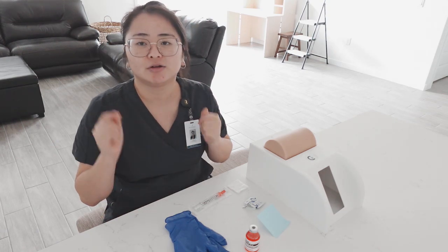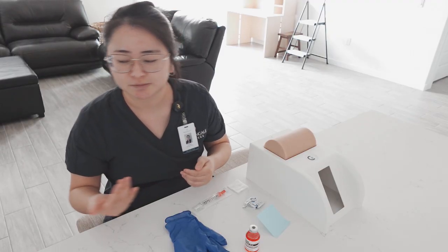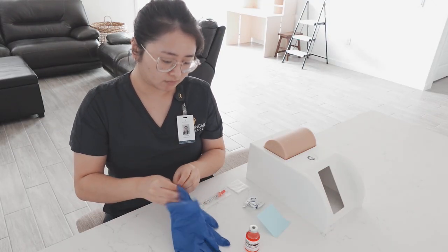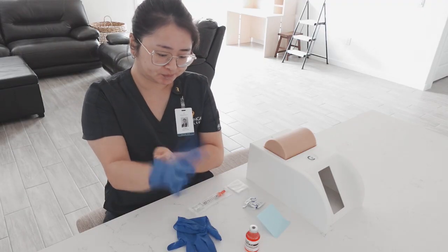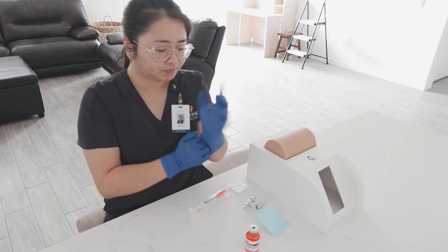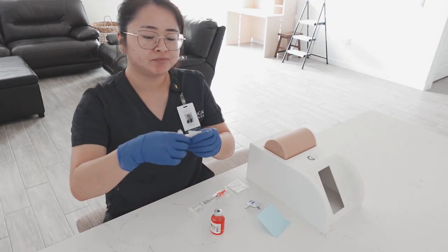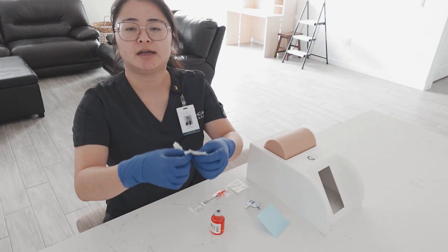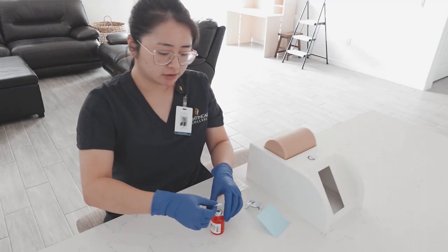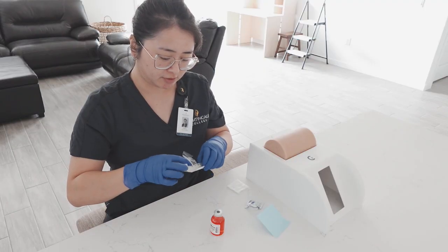No? Perfect. And then I'm going to verify the medication against the MAR for a third time, and now I'm good to administer the medication. So I'm going to perform hand hygiene one more time, and then I'm going to put on clean gloves. I'm going to take my vial, take one of my alcohol prep pads. These are open due to practice, but in real life, if they are open, I would not use them. Take this, dispose of it in the trash, clean the top, dispose of that, take my syringe.